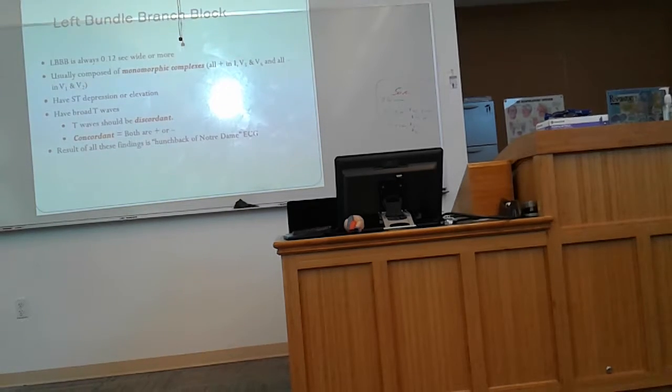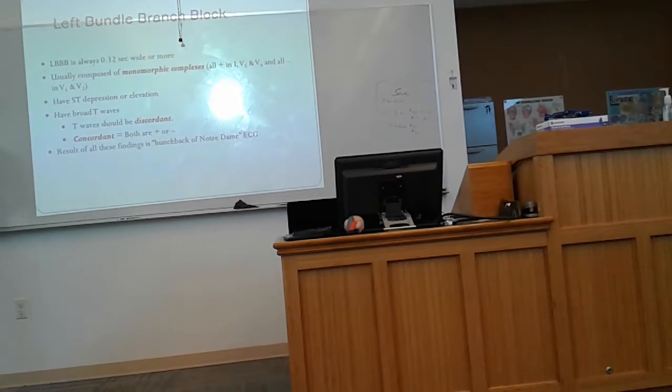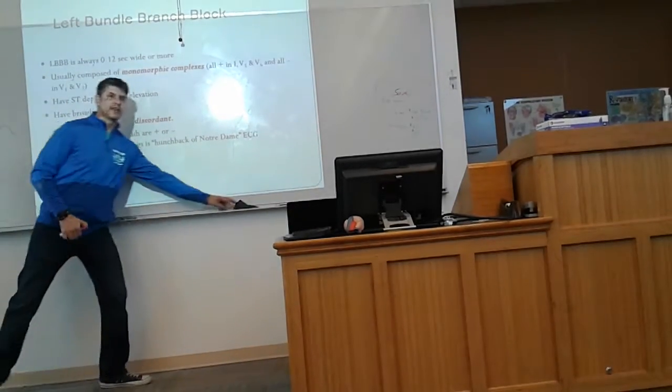Because normally we have a fast depolarization followed up by pretty much all those cells simultaneously starting their repolarization process, right? Now, the time of the QRS complex has widened, and also these cells start to repolarize before those as well, so that repolarization takes longer too. Okay. Because the timing is funky now.